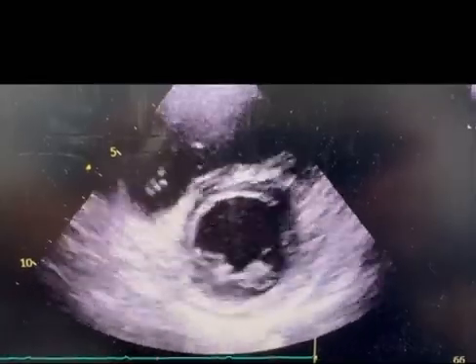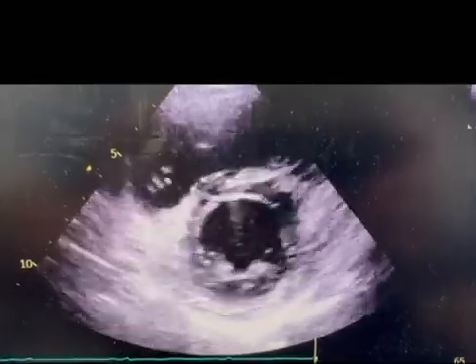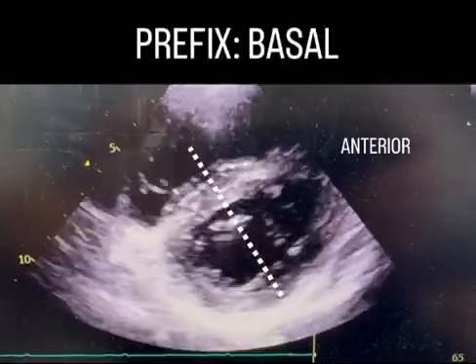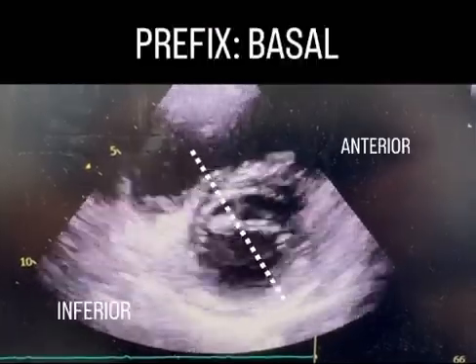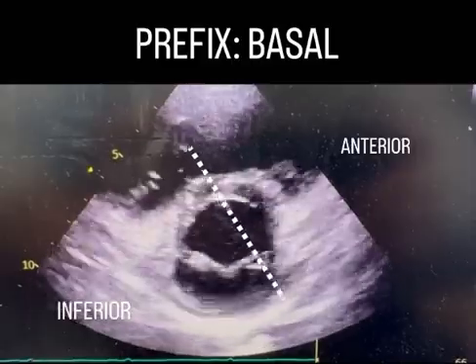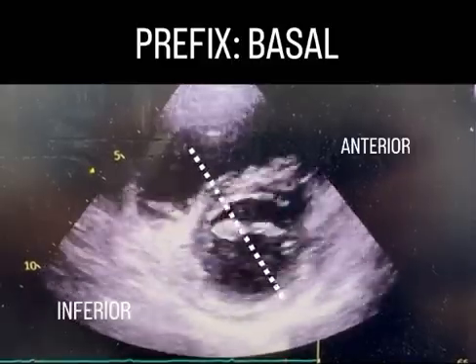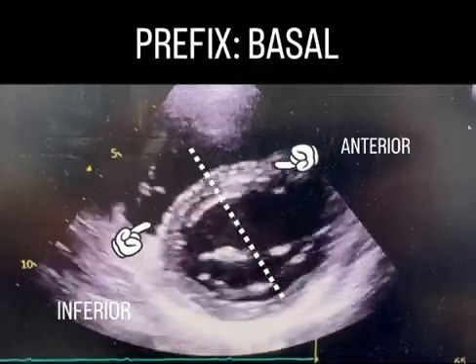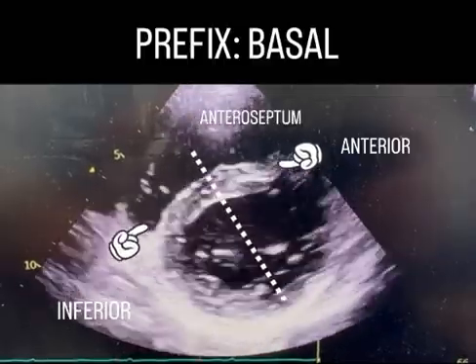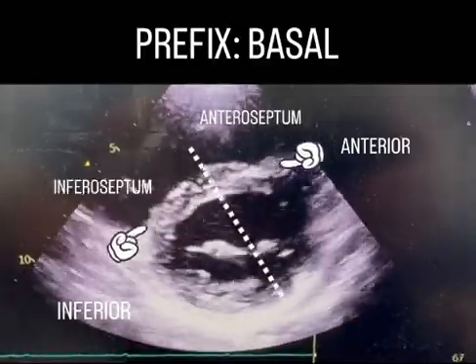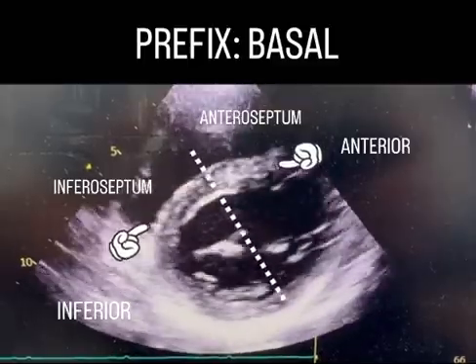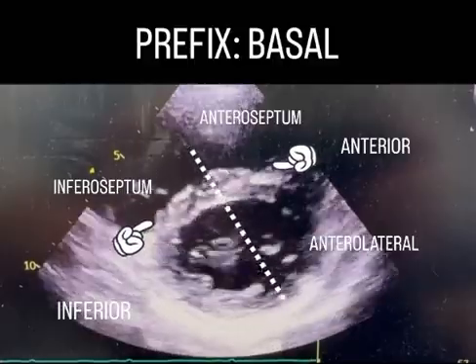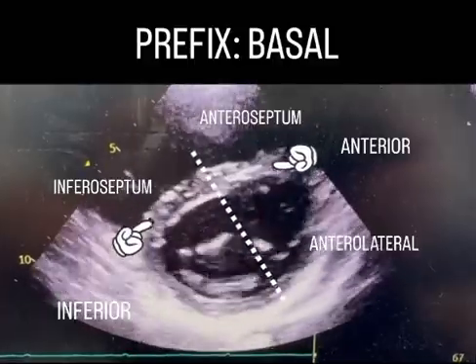To better understand regional wall motion abnormalities in the short axis view, we divide it into two sections. The first segment is the basal anterior wall and the second segment is the basal inferior wall. The interventricular septum starts where the right ventricle attaches to the left ventricle. The segments seen here are the basal antero septum and the basal infero septum. We then move to the lateral portions of the left ventricle where we see the basal anterolateral wall and the basal inferolateral wall.